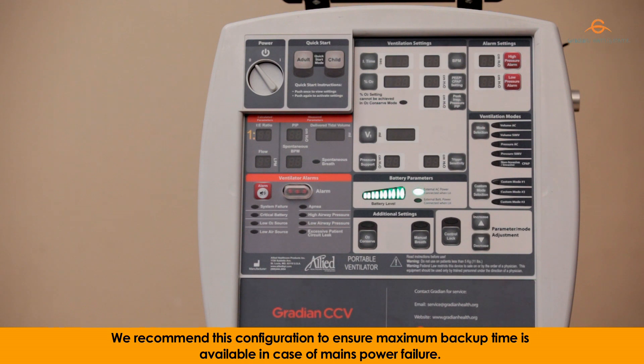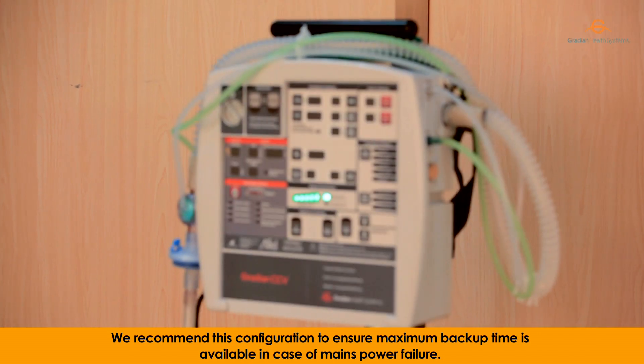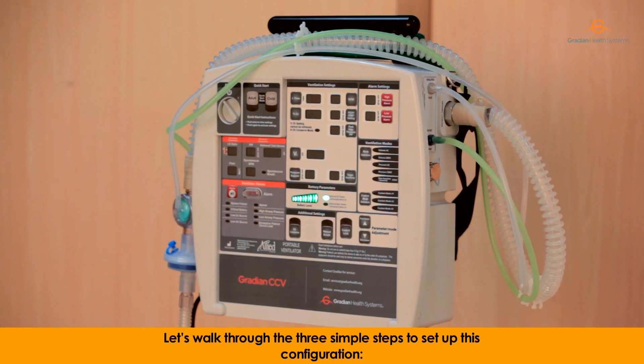We recommend this configuration to ensure maximum backup time is available in case of mains power failure. Let's work through the three simple steps to set up this configuration.